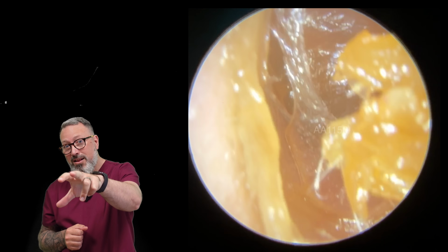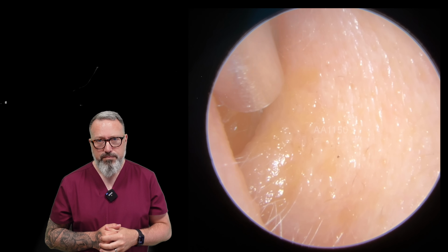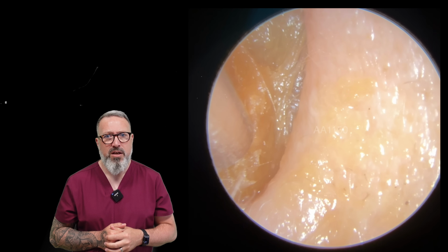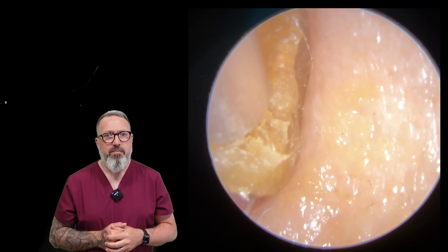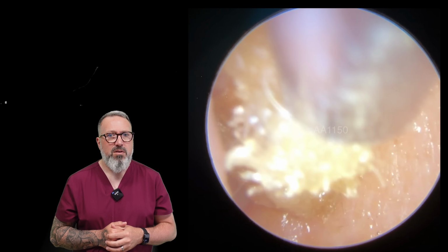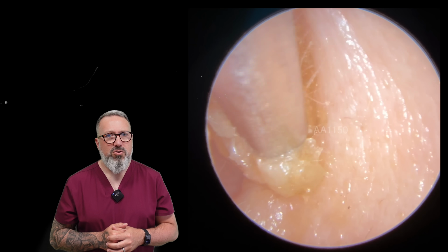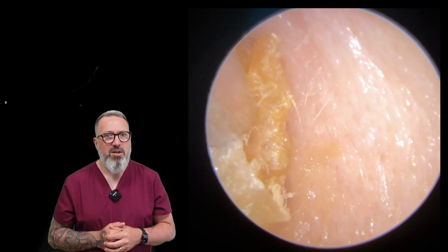Similar, you can see that layer again there over the eardrum there. So we're just going to pull this last section. There we go. Let's give this a pull. There we go. Oh, it's just catching on the outside edge there.